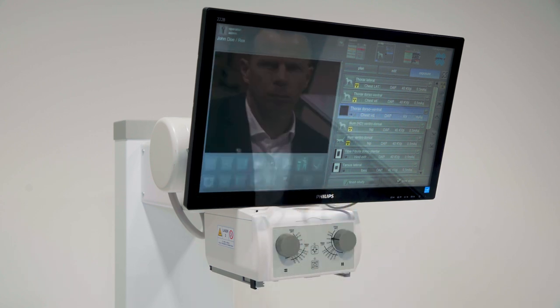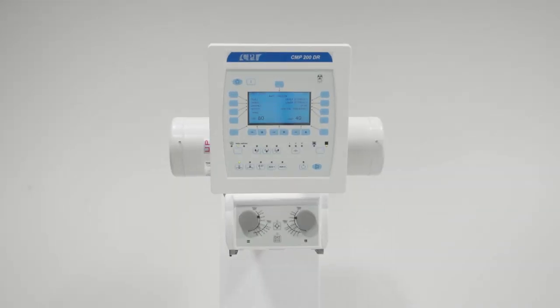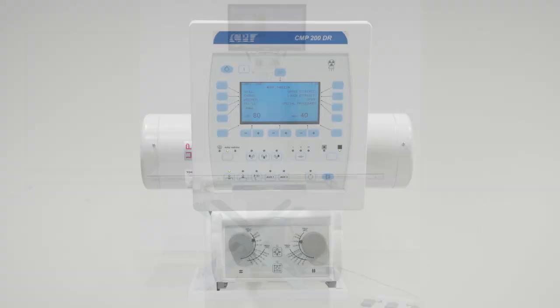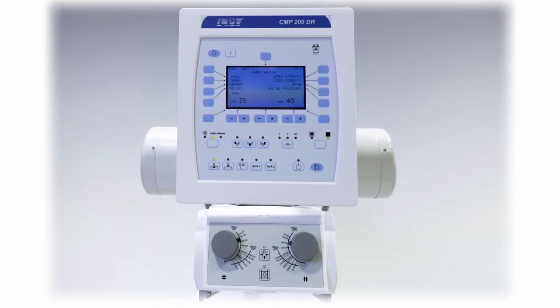Alternatively, we can mount the system with either of two membrane consoles: the ZoomX LC or the CPI RAD console. Both offer the comfort of all key generator parameter settings including APRs and advanced controls such as AEC.